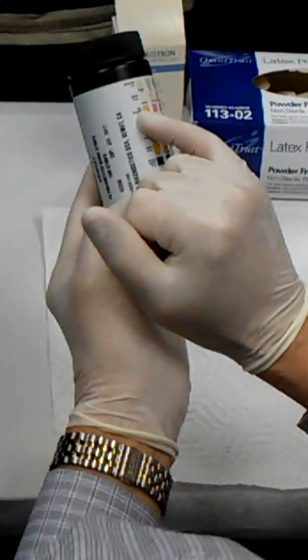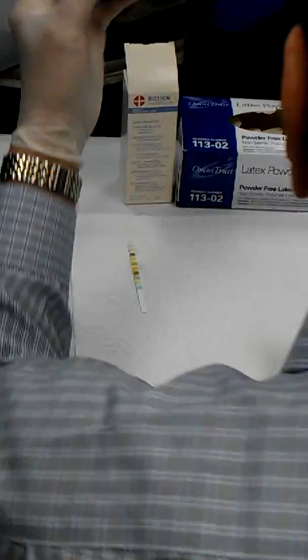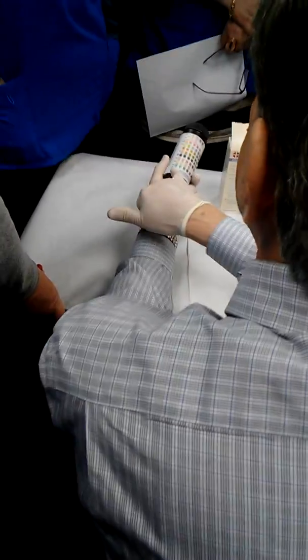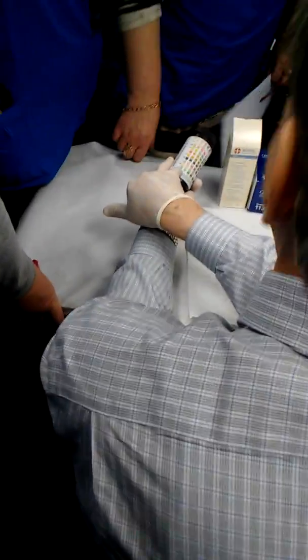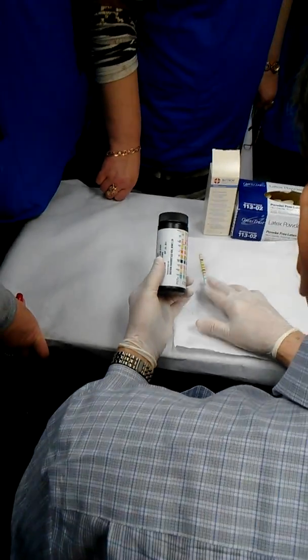So, how long do you have to wait? It's written here: 2 minutes, 60 seconds, 30 seconds, but you have to wait 2 minutes, right? Then we will be reading the result. Первый здесь или здесь? Здесь. Okay, you see this is blue, right? Blue at the bottom. Okay, so we're waiting 2 minutes.